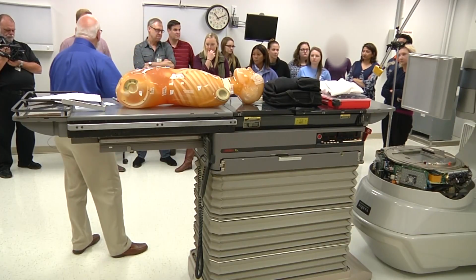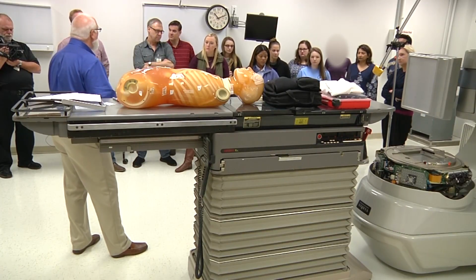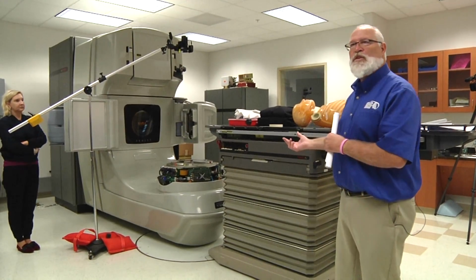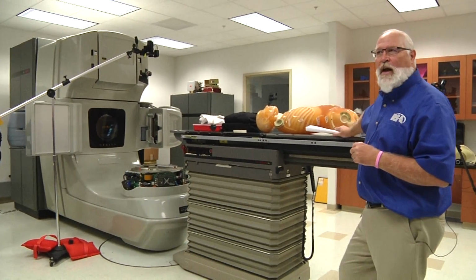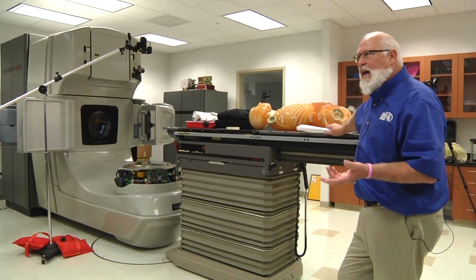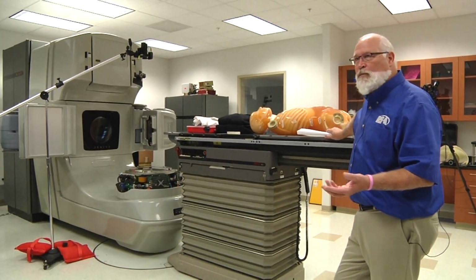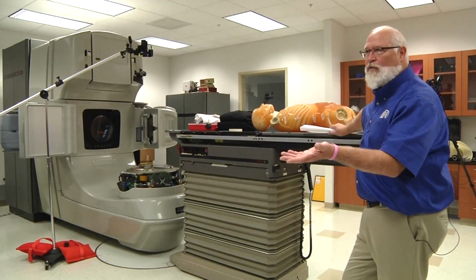We'll do some mechanical movements. We'll do a lot of cleaning, so you do a lot of housekeeping. And then we do a lot of record and verify of voltages. So we want to see if there's any changes in the performance of the machine. We'll see a voltage change. Your modulator has a couple tubes inside there. They're called thyratrons. And we measure a certain voltage on that tube. It tells us the life expectancy of the tube or when it's going to fail. And we want to replace it before it fails so you guys don't have downtime. So a lot of this stuff that we do is to prevent downtime for you.